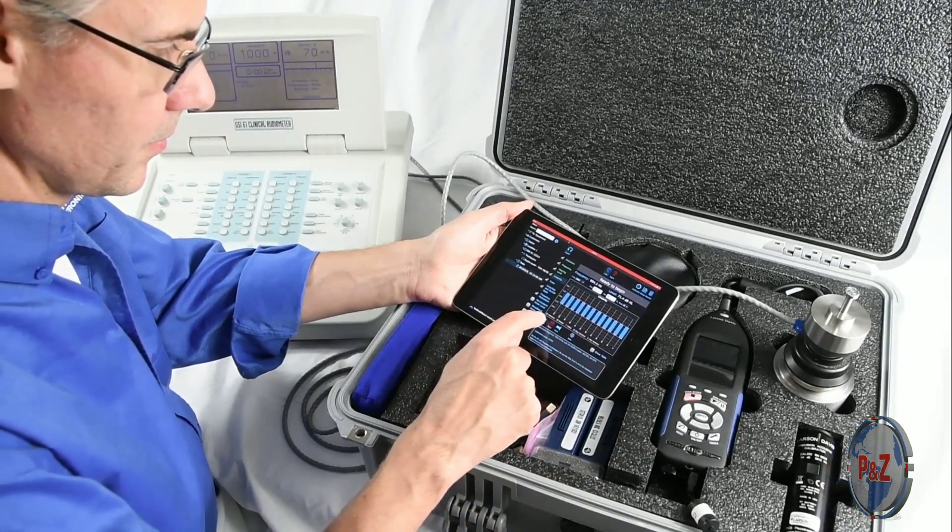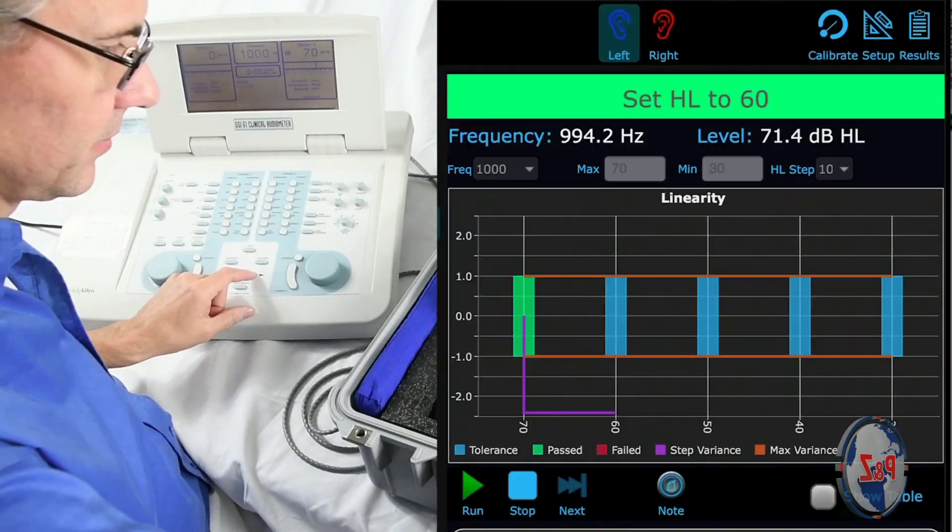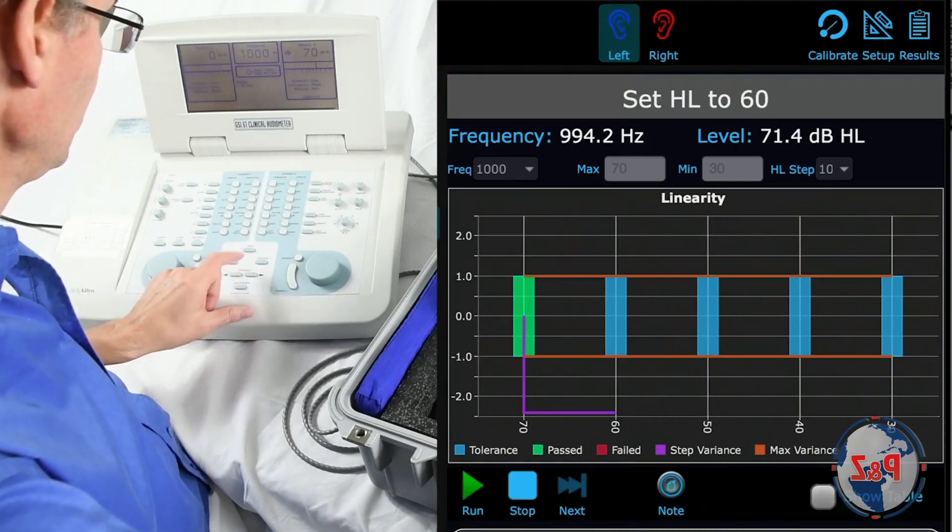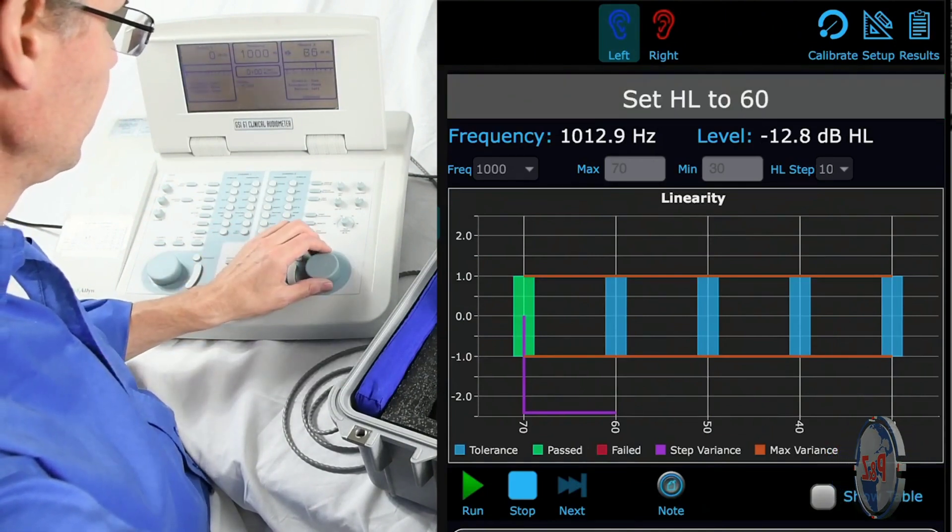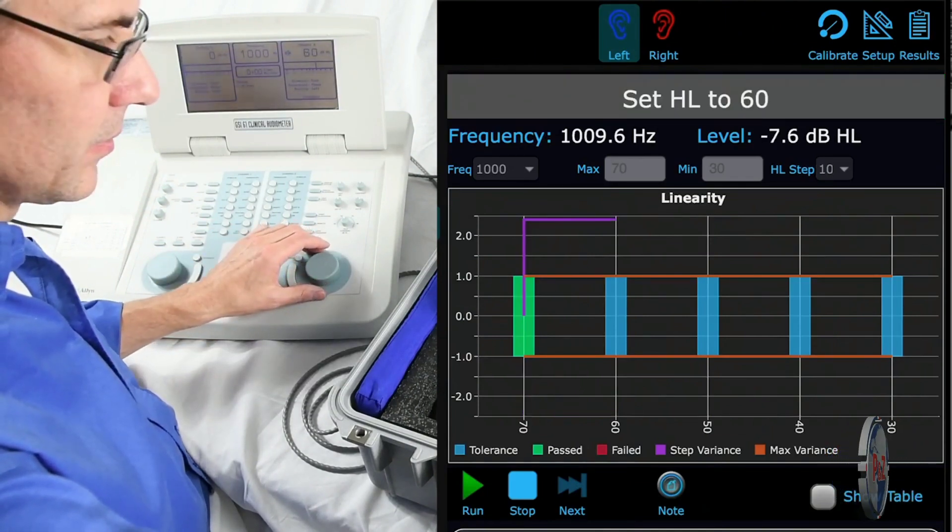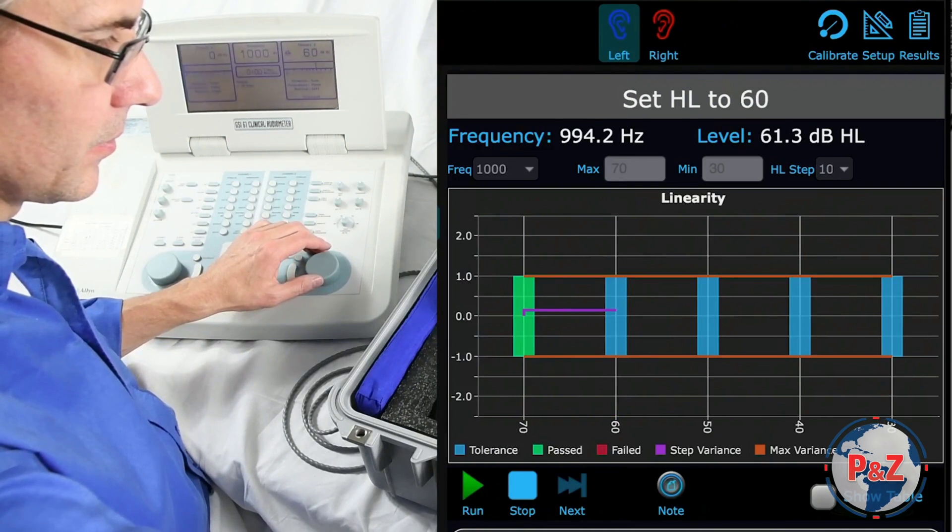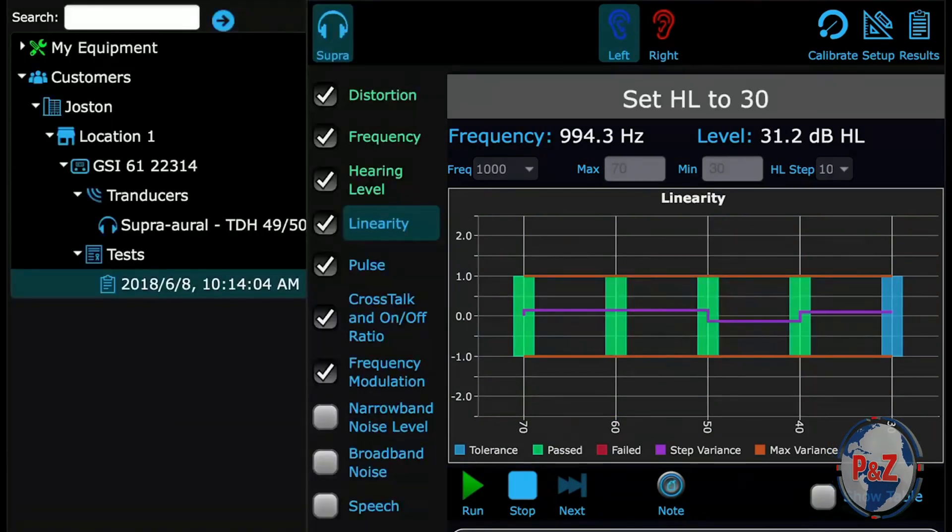Since you are not required to interact with the app during the test, you can progress through each step by adjusting the dial as soon as the signal is stable and recorded.